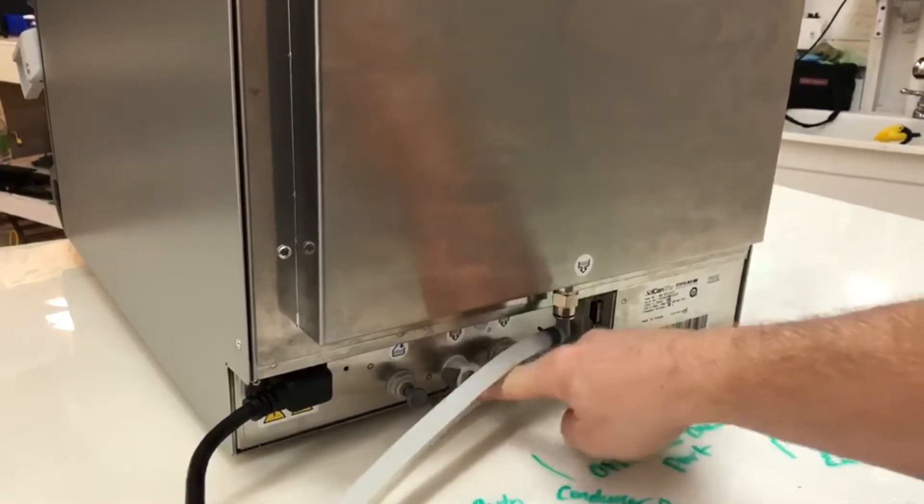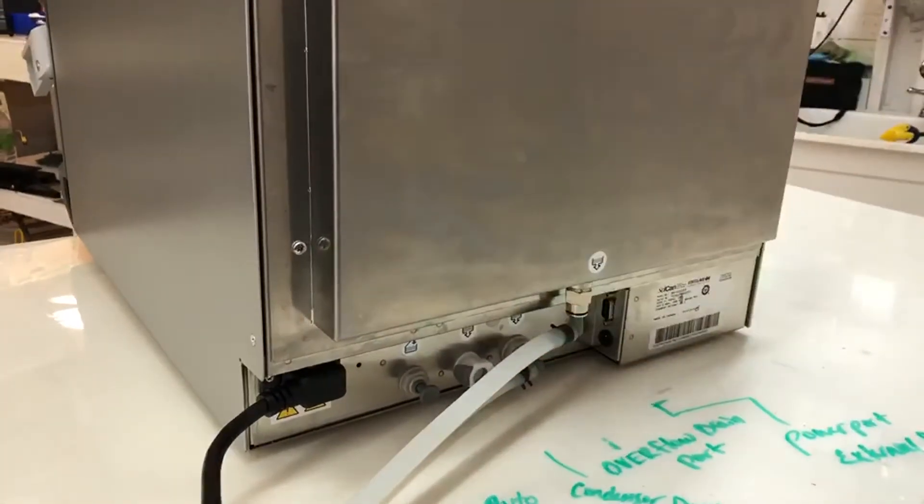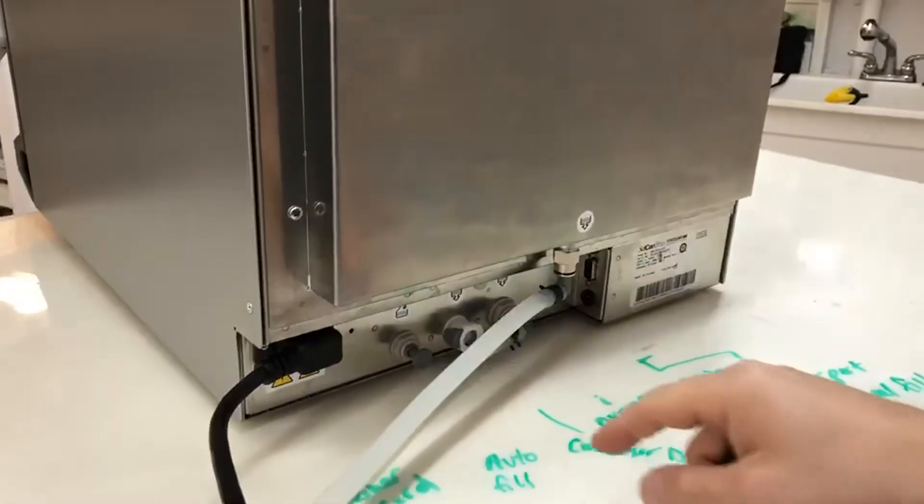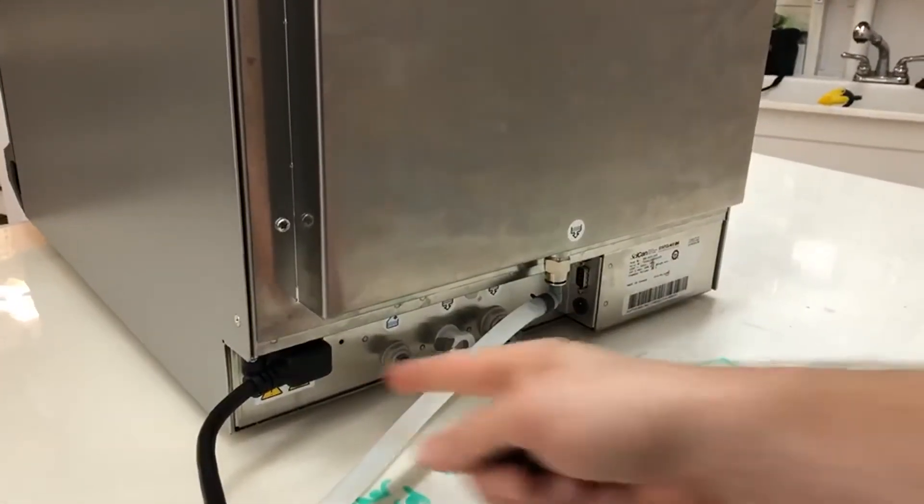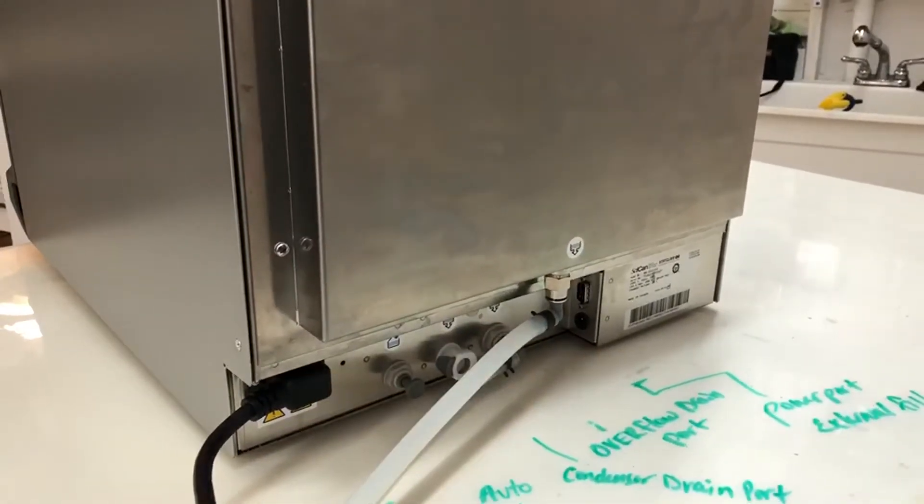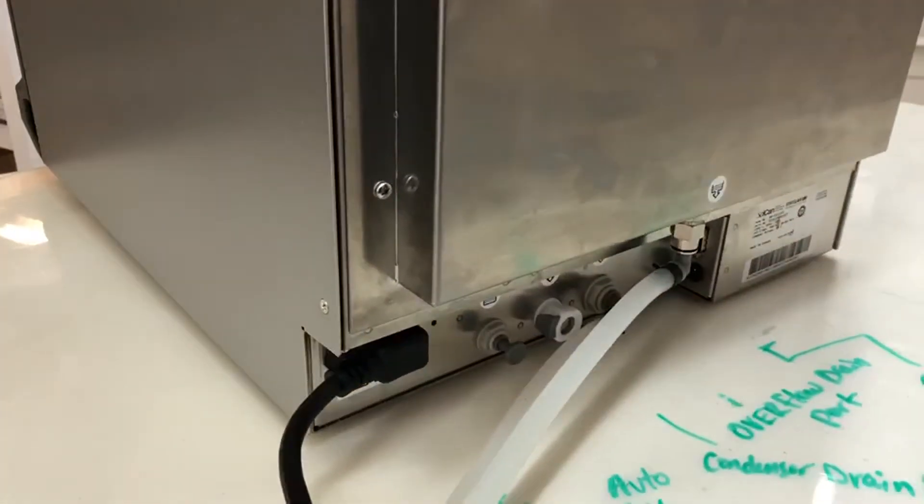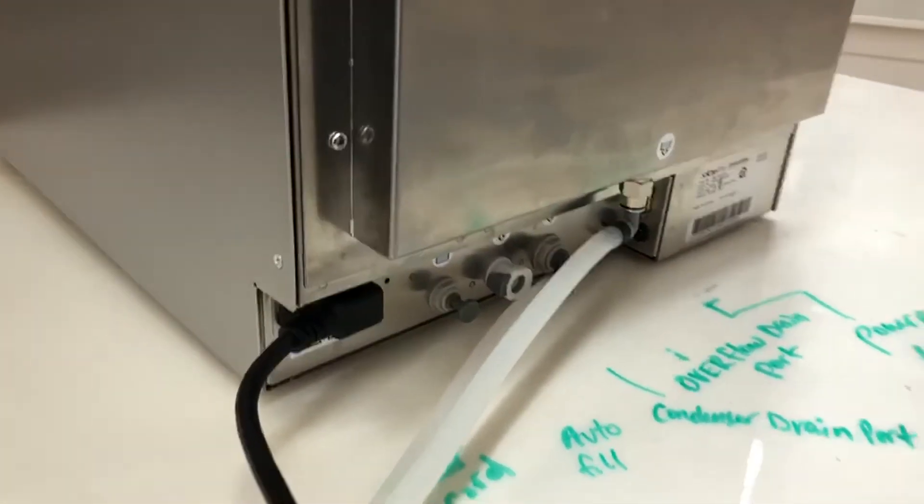This is the overflow for the freshwater tank. There's an autofill option you can do here. And then this is where your power cord is. And then this is an overflow port right here for the venturi. So you're going to want to hook those tubes up. Let's go back to the front.